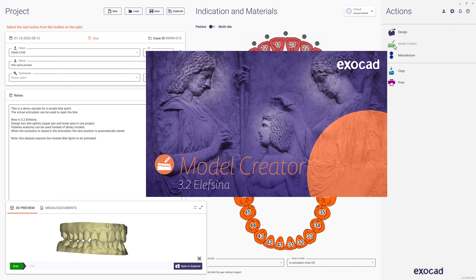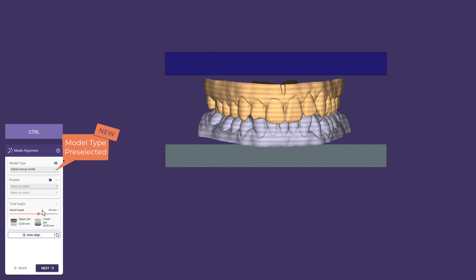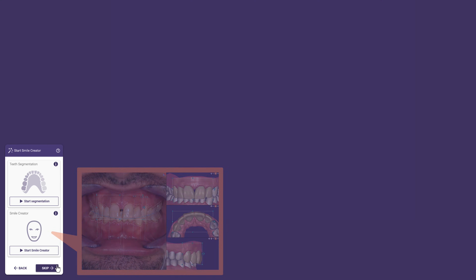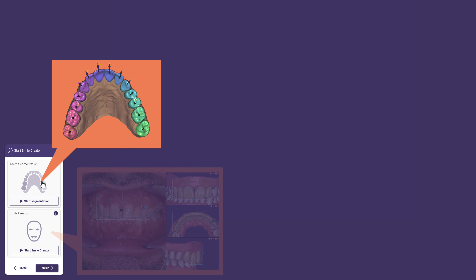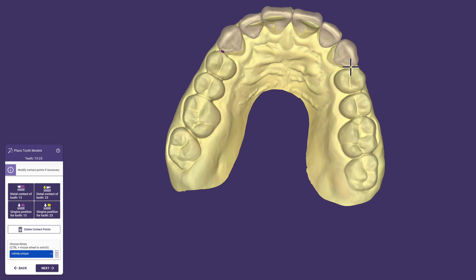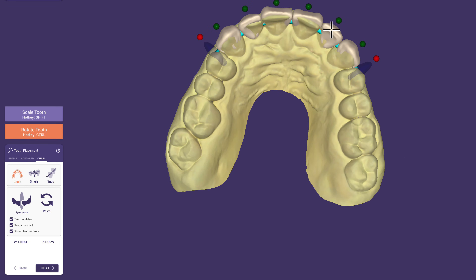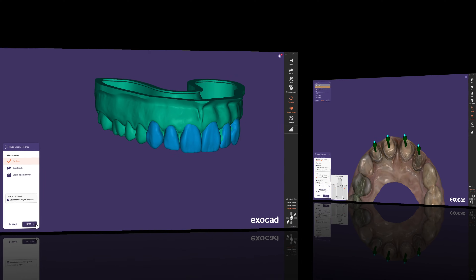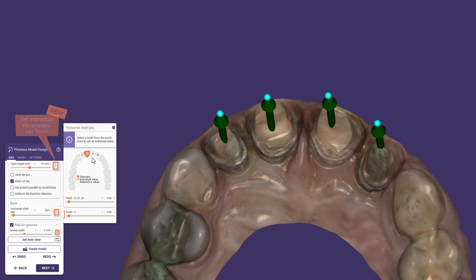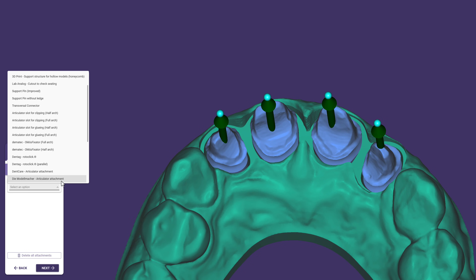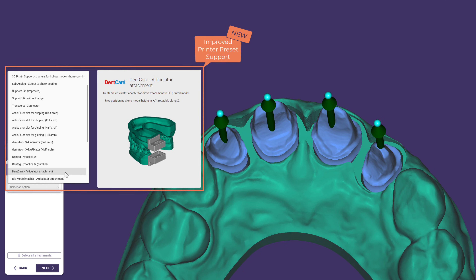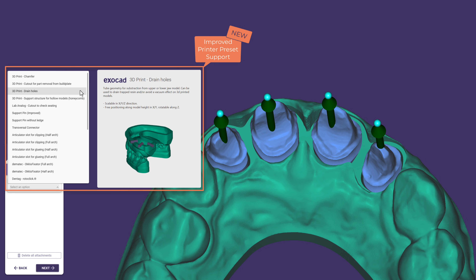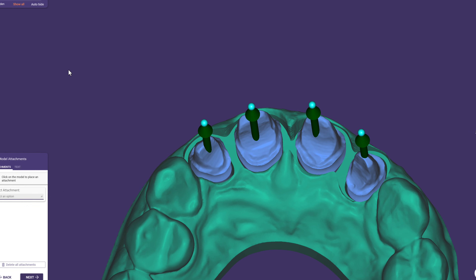Let's have a look at the improved model creator. We have added a workflow to help you design mockup models faster than ever before — you can make use of the migrator or a new segmentation. The wizard guides you through setup quickly and efficiently, and finally merges design and model so you can print this diagnostic mockup right away. We also added per-tooth parameterization for individual die adjustment, improved printer preset support, and added helpful explanations and illustrations to attachment types.